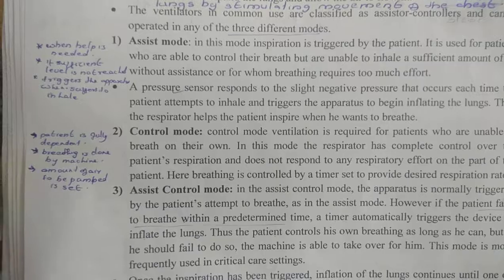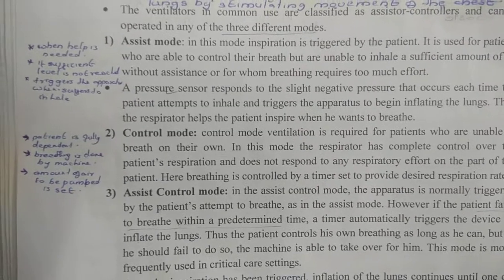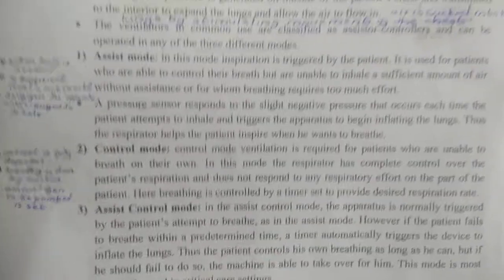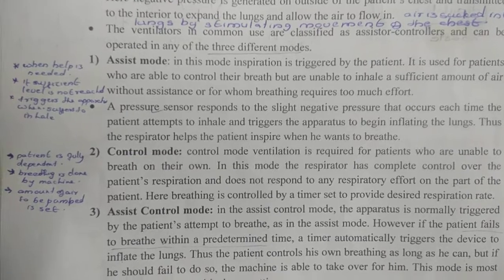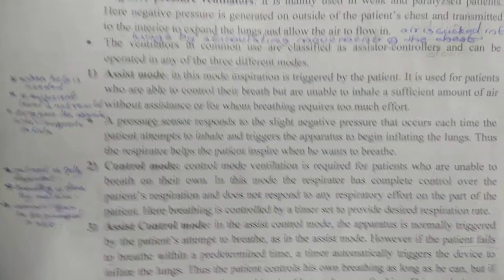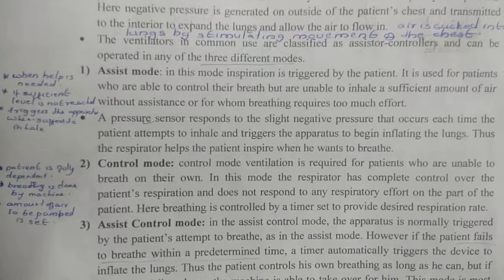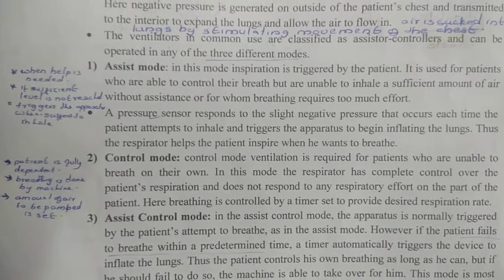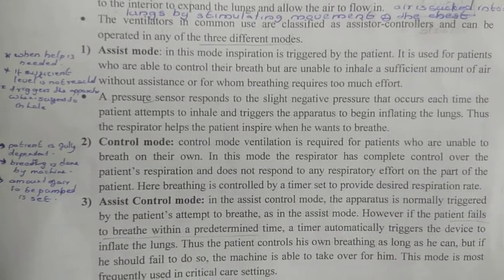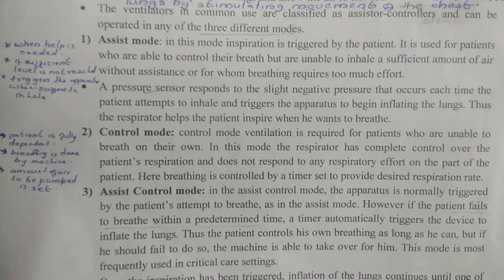Let's consider the three modes of operations. First is the assist mode, then the control mode, and the assist control mode. In assist mode, it works whenever a patient requires help. That is, the patient is not completely dependent on the device, then we use the assist mode.